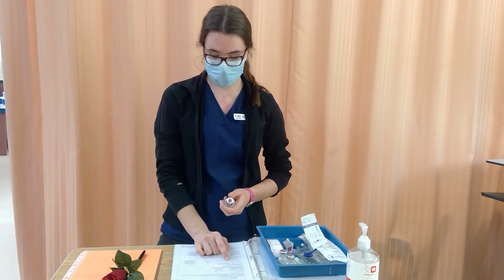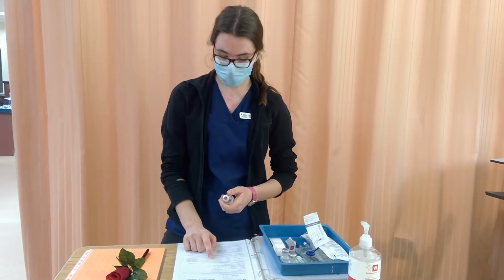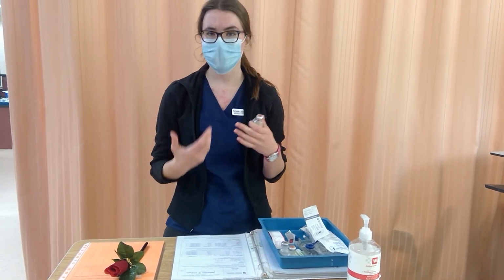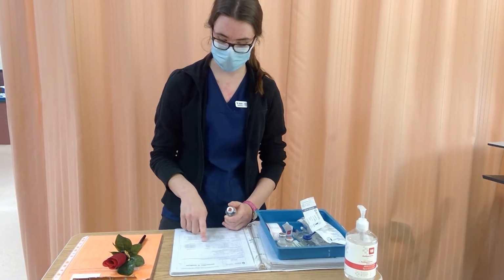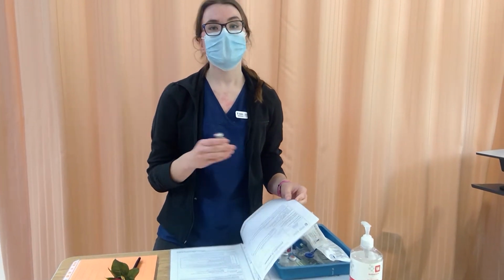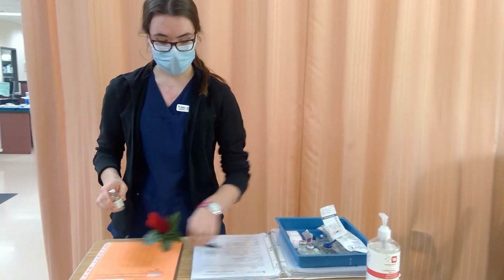For reconstituting, I've decided to reconstitute with 8.2 milliliters of sterile water for a final volume of 10. That way it'll be more diluted than if I just reconstituted it to 5, because it's one of his first doses. And I'm going to be diluting it in 100 milliliters of normal saline for the same reason, and administering that over 30 minutes like it's recommended. Some side effects are an allergic reaction, so any rash, itchiness, and difficulty breathing. I'm going to let him know about that.